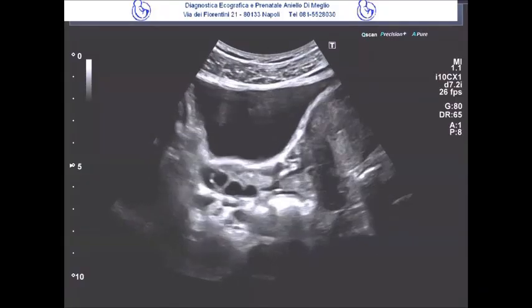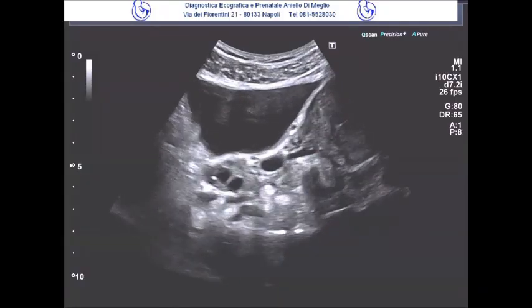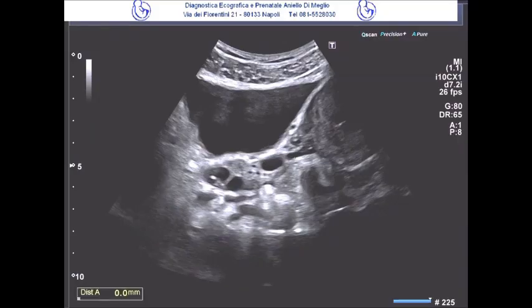Furthermore, their echogenicity, that is, the way they reflect the ultrasound waves, is consistent with that of healthy ovarian tissue, which suggests there are no suspicious masses or cysts present.